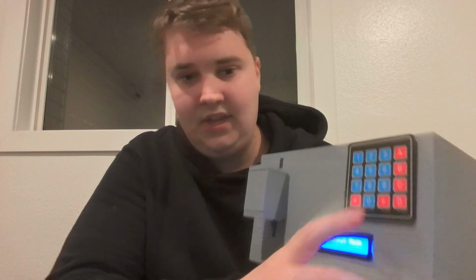So I can press any of these. I'm going to choose 5. Now that it's done that, it's asking me to input an hour value. It takes 24-hour inputs. So since it is 1 in the morning, it's 01, midnight would be 00, 11 at night would be 23. So that's the range. So now we will input 0, 1. And it's telling me that I input 1. Now I need to input the minute value that I want.